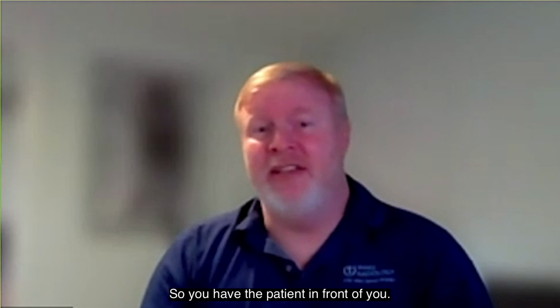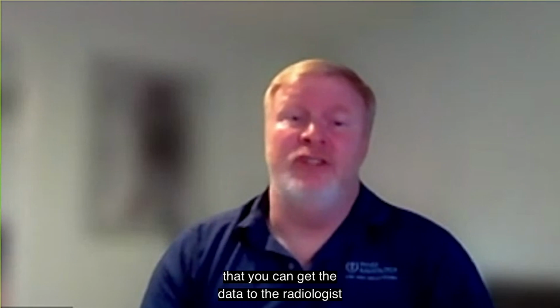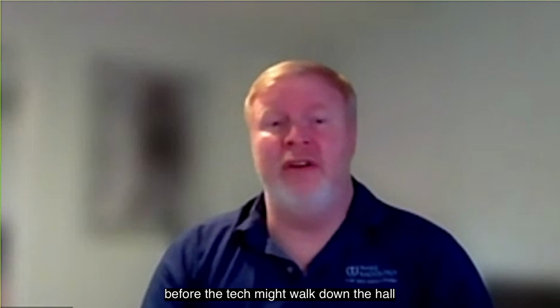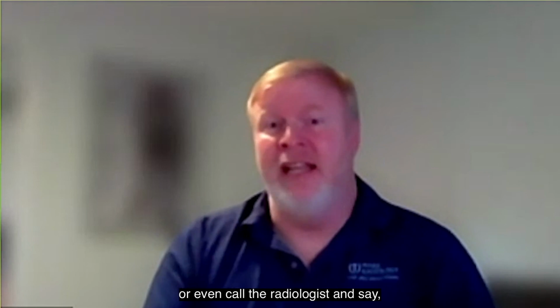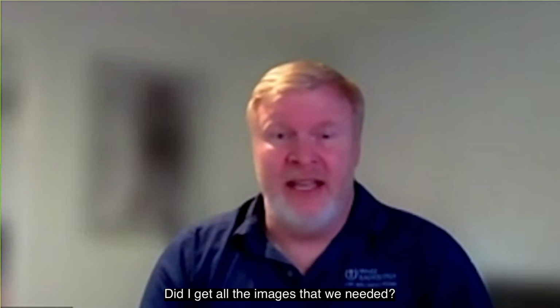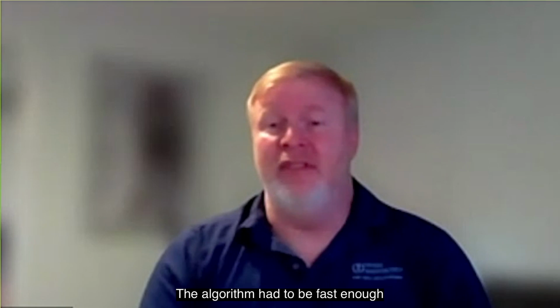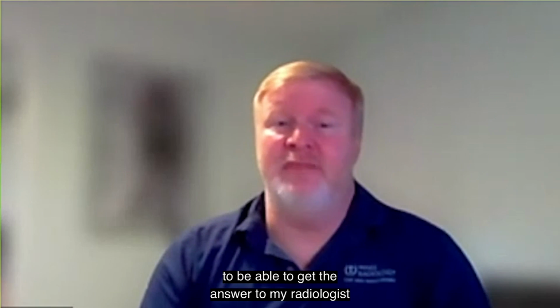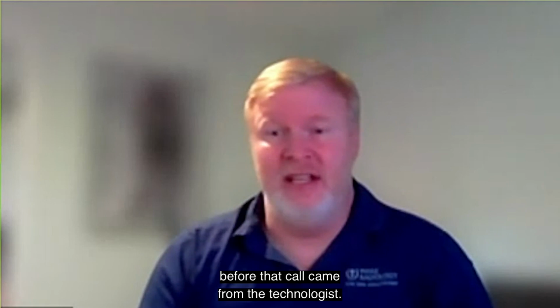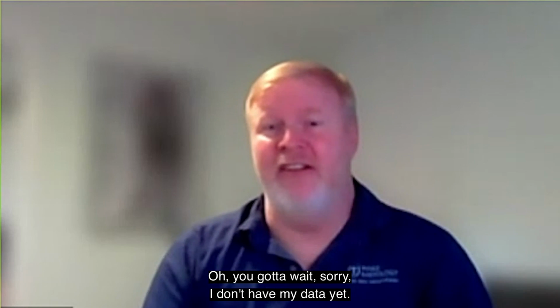So you have the patient in front of you. You need to be able to process these exams fast enough that you can get the data to the radiologist before the tech might walk down the hall or even call the radiologist and say, did I get all the images that we needed? And that was one thing that I was worried about. The algorithm had to be fast enough to get the answer to my radiologist before that call came from the technologist. I didn't want the radiologist to tell the technologist, oh, gotta wait. Sorry, I don't have my data yet.